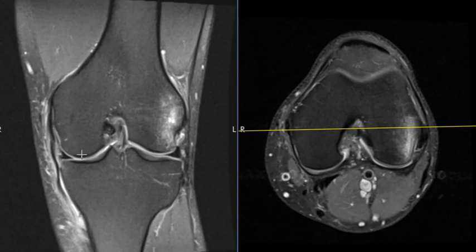On this side we have a medial femoral condyle and the medial tibial plateau down here, and this is the medial meniscus. The medial meniscus doesn't look quite right. The lateral meniscus is a beautiful triangle — the outside of it is sharp and vertically oriented. On the medial side we see a little bit of irregularity along the outside. This is called the capsular surface. Here's the superior articular surface, inferior surface, and this is the peripheral rim or capsular surface.